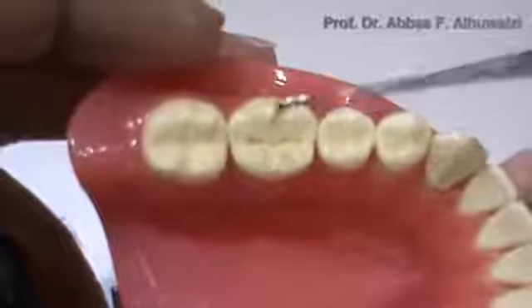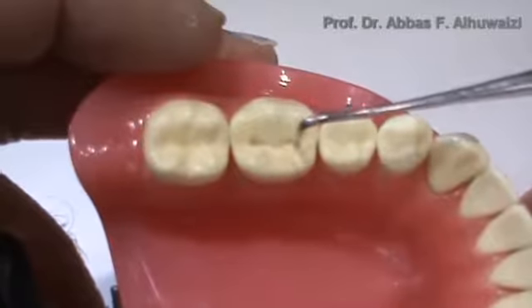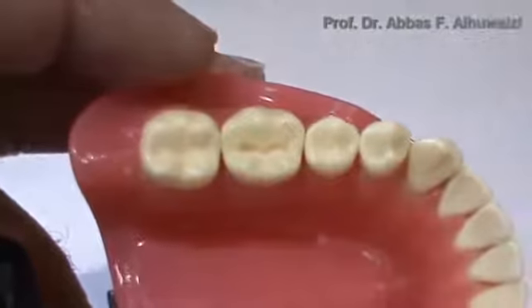As you could see here, we have to make the shape of the cavity rounded without any sharp corners.